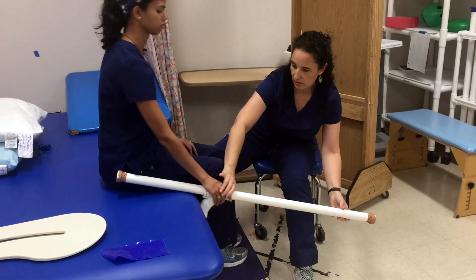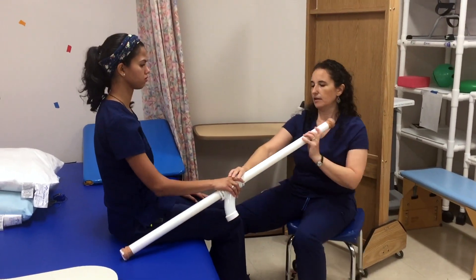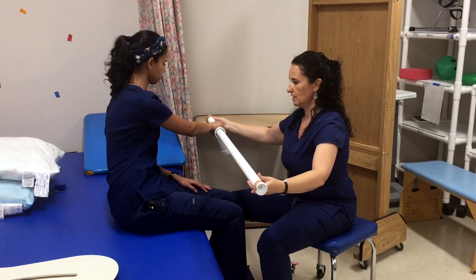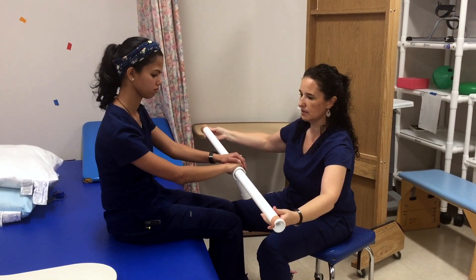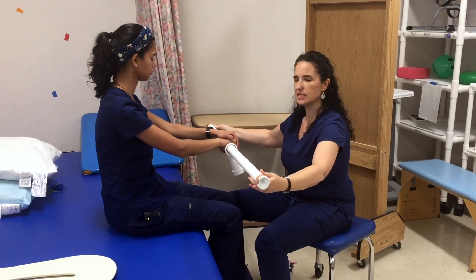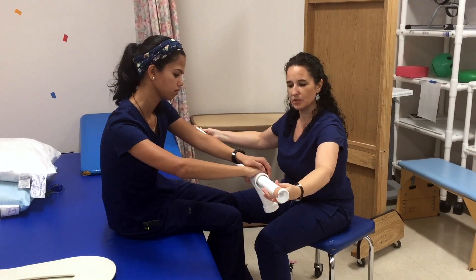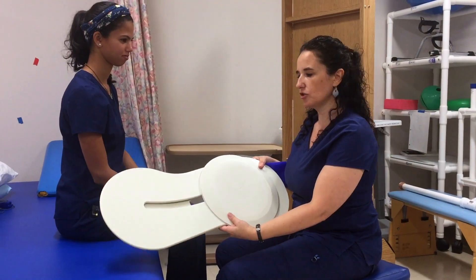Shoulder flexion. You can also do it this way. The patient could be laying down — they don't have to be seated. Some great ideas to add more practice.